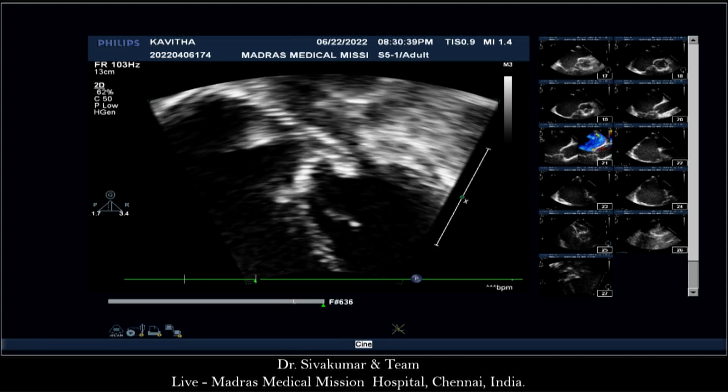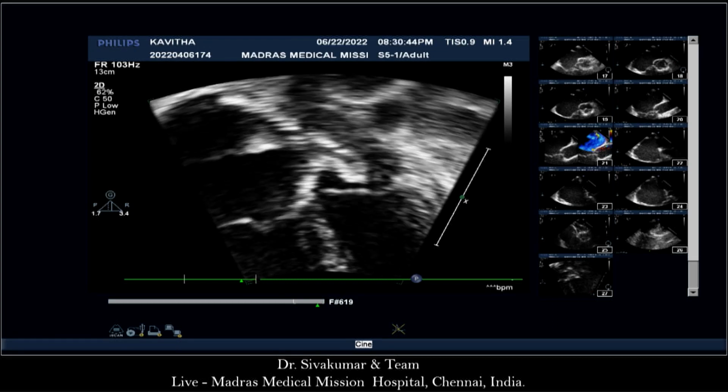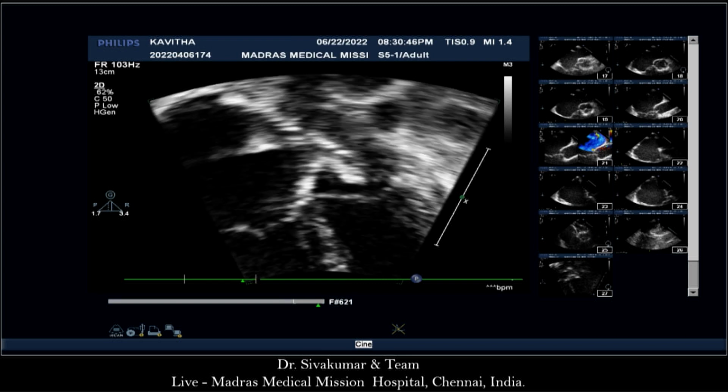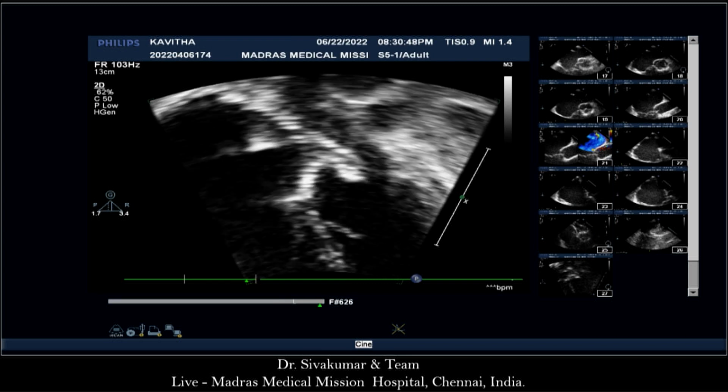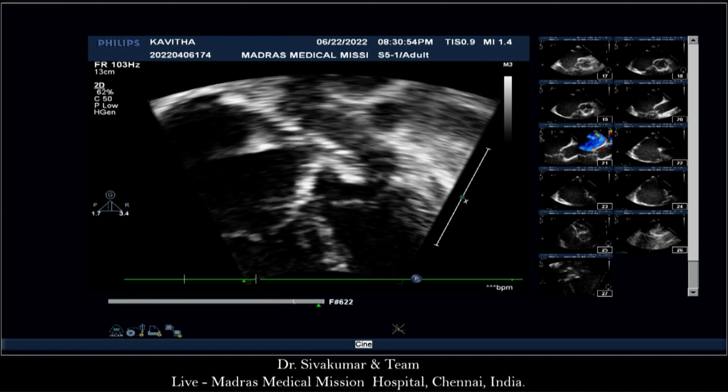The left atrium, yeah, I mean it's touching it there. So when the patient is awake, his blood pressure will be higher. It will be a totally different dynamic. The angulation is such that it's pointing towards the left atrium quite a bit. Yeah. But it may not change because the device is so big.